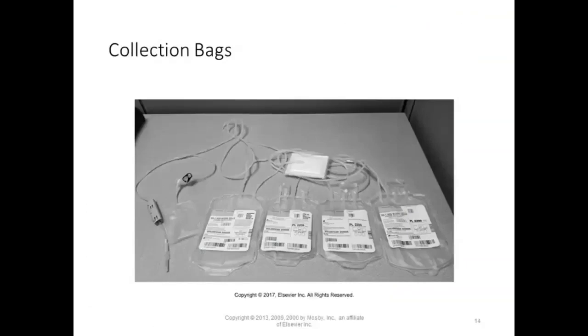Afterwards, once they take it to the back, the processing center, you'll get your plasma, your fresh frozen, cryo, and then platelets, I think, may be in this bag.